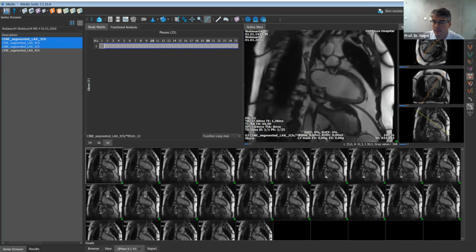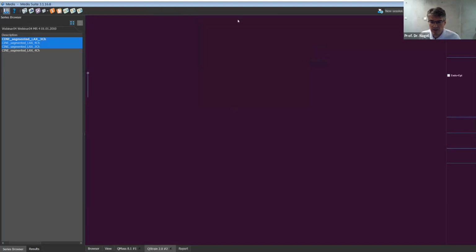And so when the image quality is worse, for example, post-contrast injection, the tracking will be less precise. We tend to do the images we use for feature tracking before we inject contrast agent, whereas we used to do most of the cine imaging post contrast agent. So we have changed that when we do want to do feature tracking.